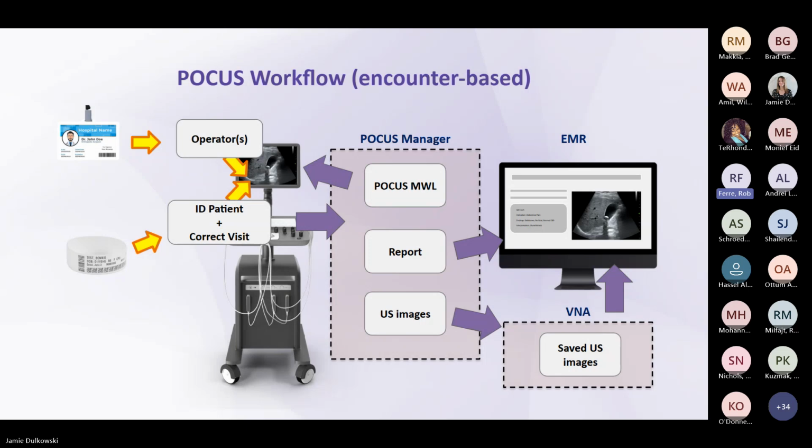This point-of-care ultrasound workflow is described here. Basically, the core part of this, and Steve will talk about this in a minute, is what we describe as the point-of-care ultrasound manager. The point-of-care ultrasound manager is able to do the things that are necessary for this encounter-based imaging workflow.